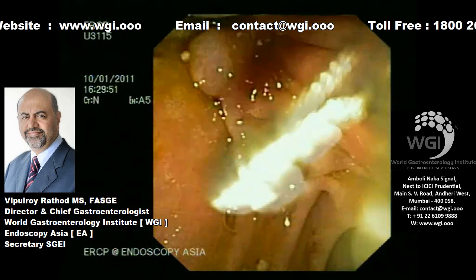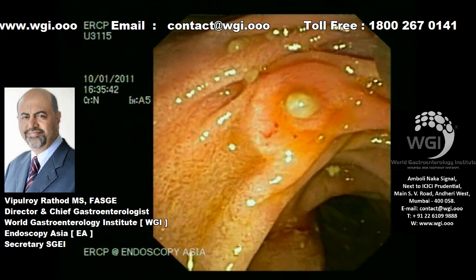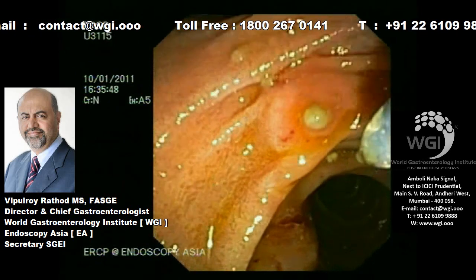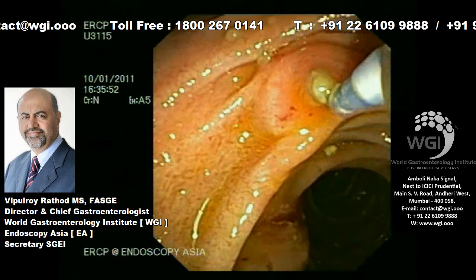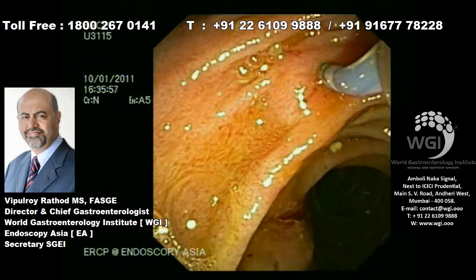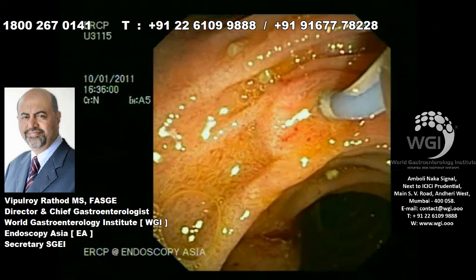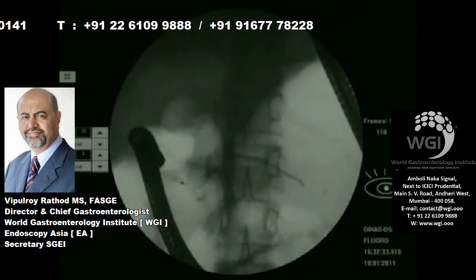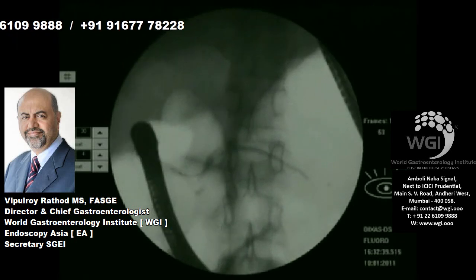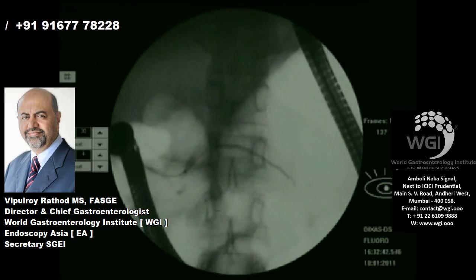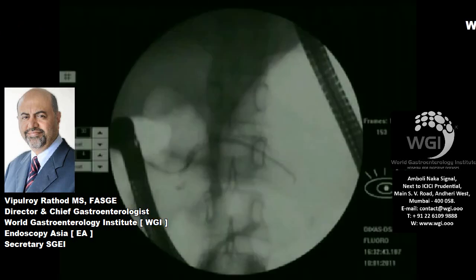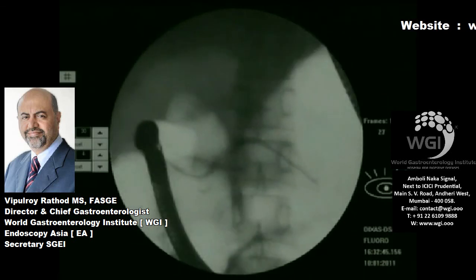This patient will definitely need endotherapy. We are now going after the minor papilla — you can see some concrements trying to exude out of the minor papilla. It is our practice that once we dislodge a concrement, we cannulate with a guide wire and cannula. You can see I am cannulating the pancreatic duct through the minor papilla in a big loop position — you must see on fluoroscopy that I made a big loop in the stomach to get proper stable access through the minor papilla into the pancreatic duct.